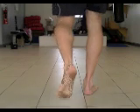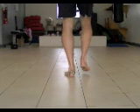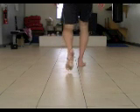Now with the long lever strip in place, we see even more control or deceleration from all the toes. With the second long lever strip in place, we can see that the foot is oriented more vertically.